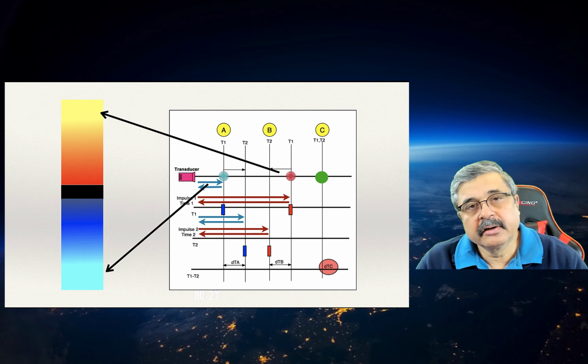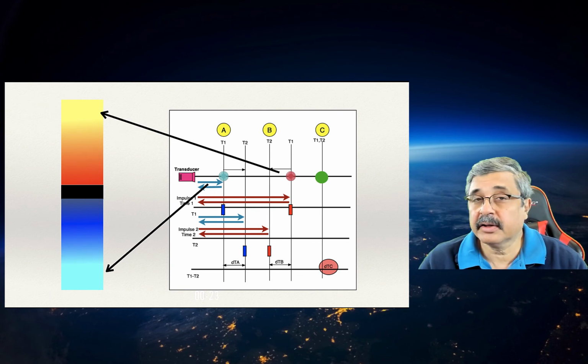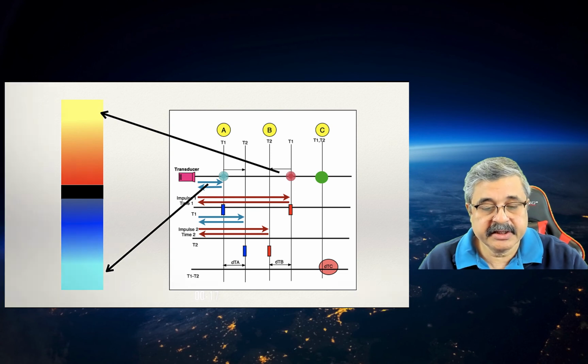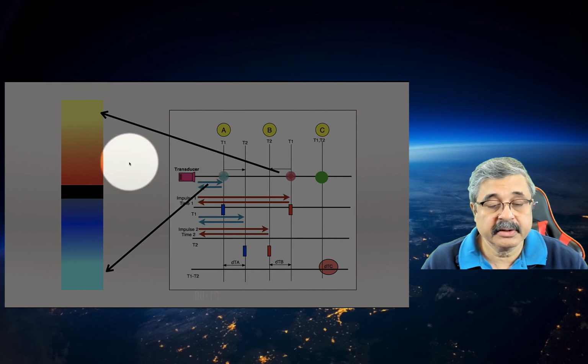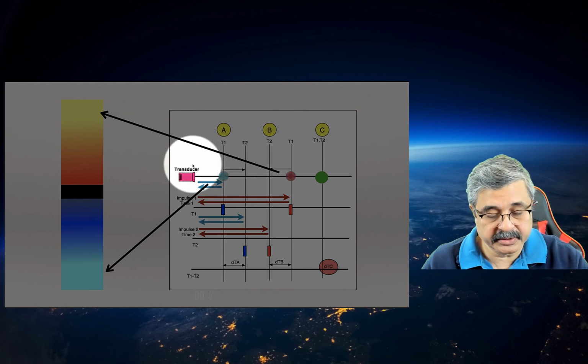So in this final review, we'll put together the concepts of phase shift and color packets with that of a velocity profile that we see and use during routine echocardiography. As you can see, this blue line corresponds to this RBC that is moving away from the transducer, and the red portion corresponds to the RBC that is moving towards the transducer.